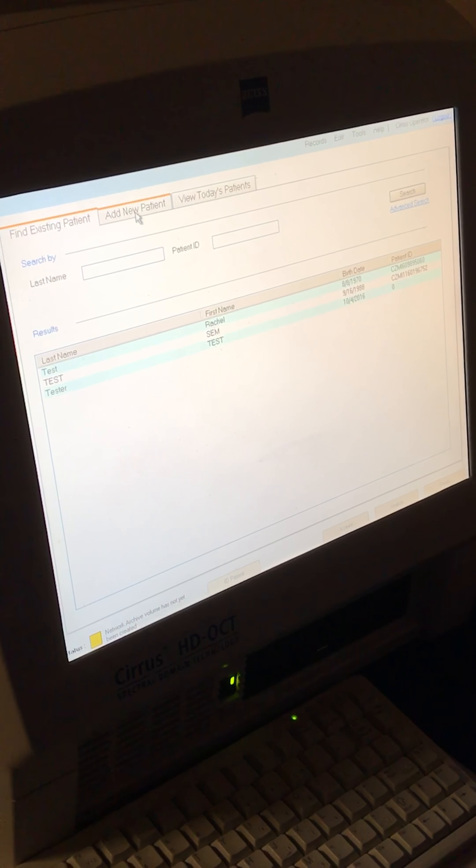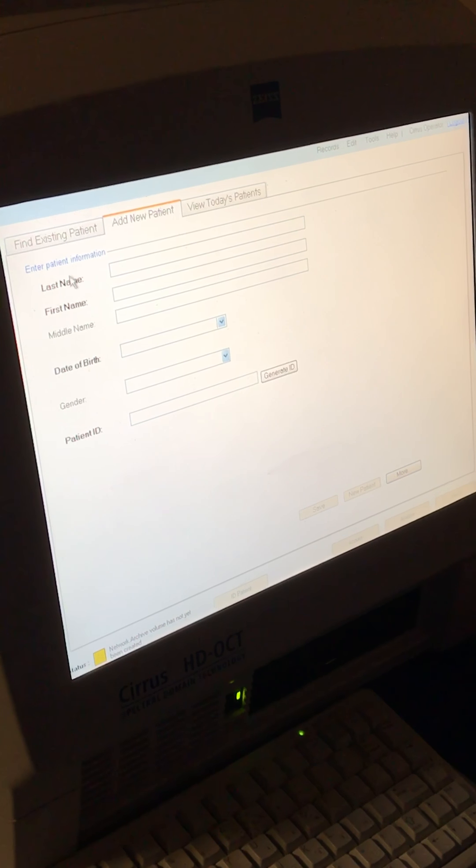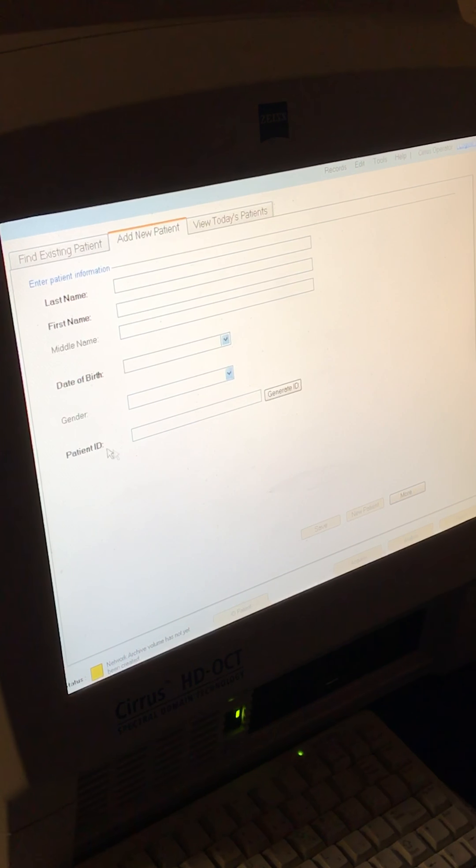To add a new patient, we'll go to add new patient tab here. We'll type in their last name, first name, date of birth and ID.